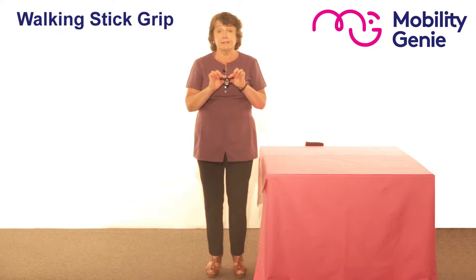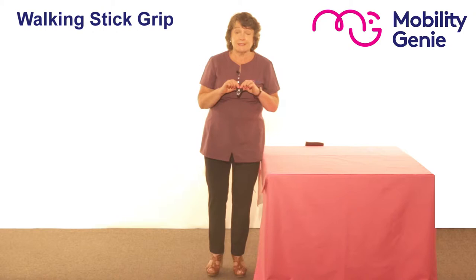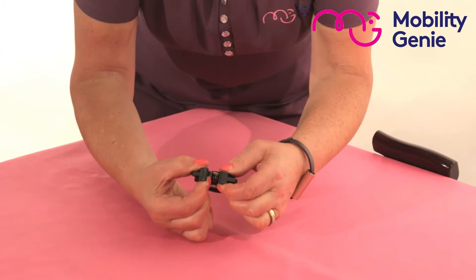Deirdre from Mobility Genie. At Mobility Genie we recommend this simple walking stick grip. It's a value for money grip that clasps onto the stick, allowing it to be balanced at the edge of a worktop or table. It fits most styles of sticks.